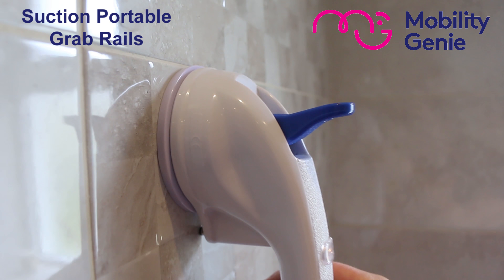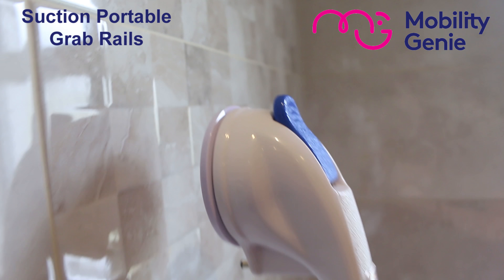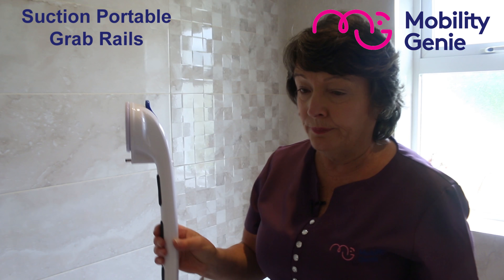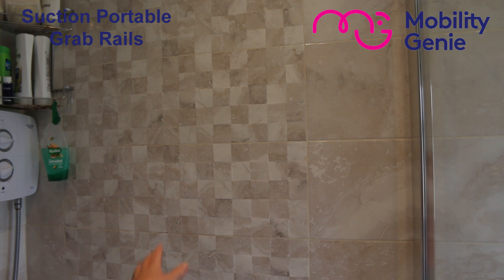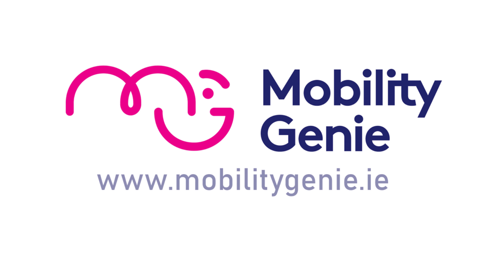They come in two different sizes so they can be used like any other grab rail — either vertically, at an angle, or horizontally. Vertically, I'm putting it in the correct position over a flat tile. These have to be put on a flat surface. Placing it on the flat tile, you can see the red mark here. I'm pushing it until it goes green and then I lock it in. The same with the bottom one — pushing it until it goes green and locking it.